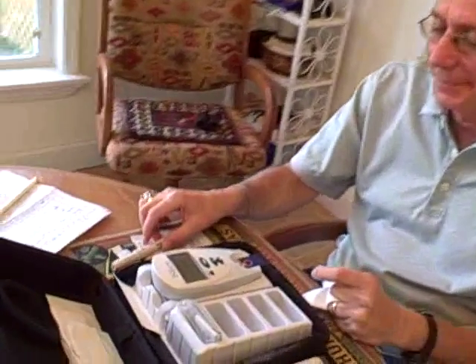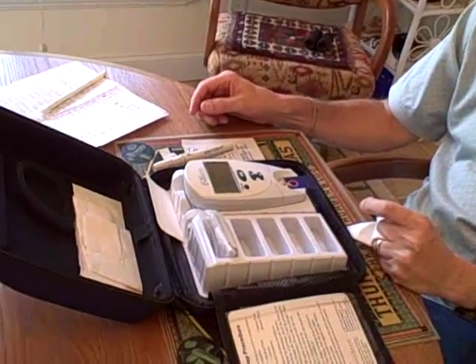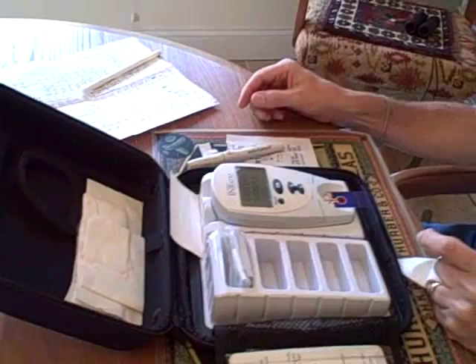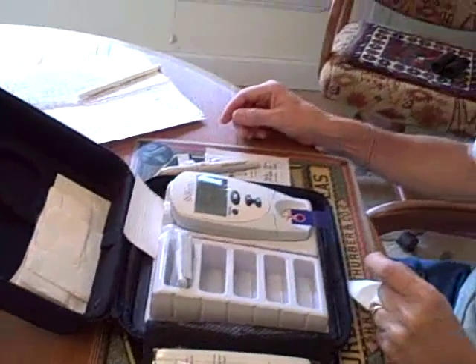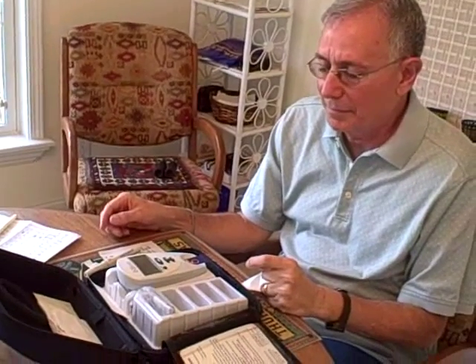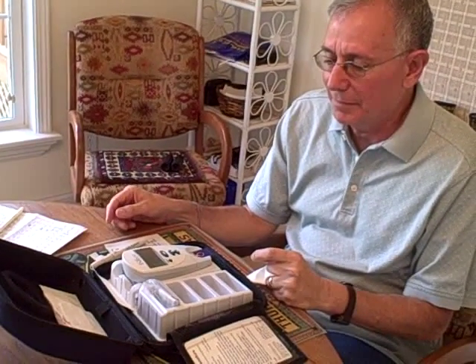Now we wait for the test to come back. And while we're waiting, we can give you a little bit more information about how this works. First of all, this is a fairly new model. It doesn't require refrigeration for the test strips.